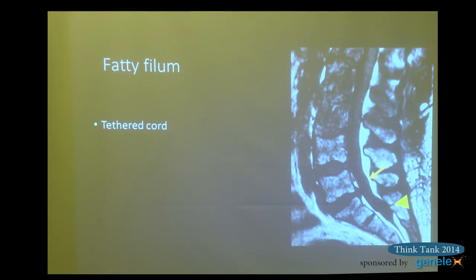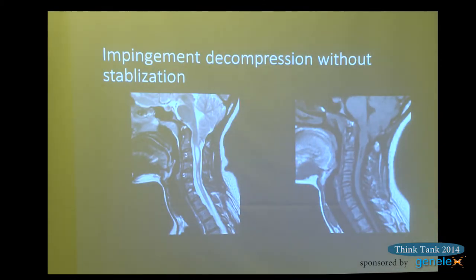When we see a fatty filum, that suggests there's abnormality with the connective tissue and the cord is under tension. Most of the people with EDS that we see, even though they have symptoms of a tethered cord, there's no imaging correlate for that. These are being done to make sure that we don't have a fatty filum or a tumor, the lipoma. There's little problems that we're recognizing.